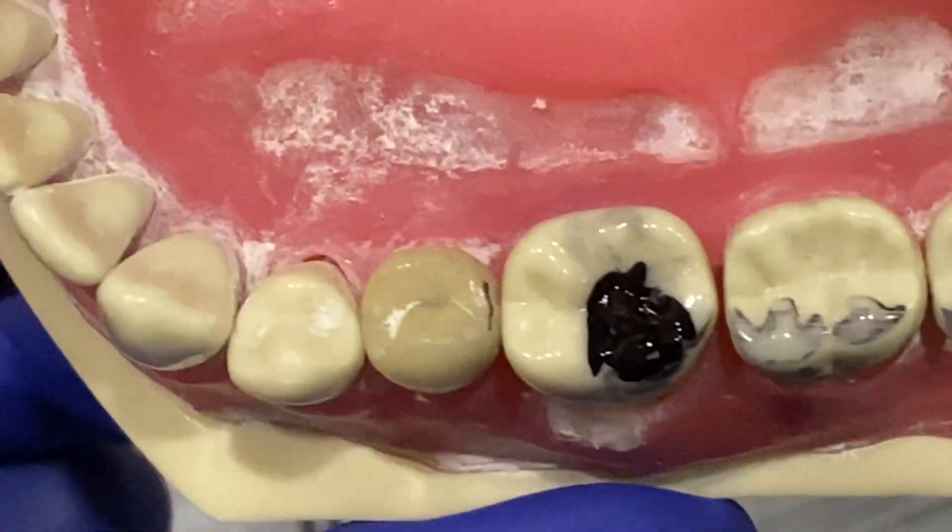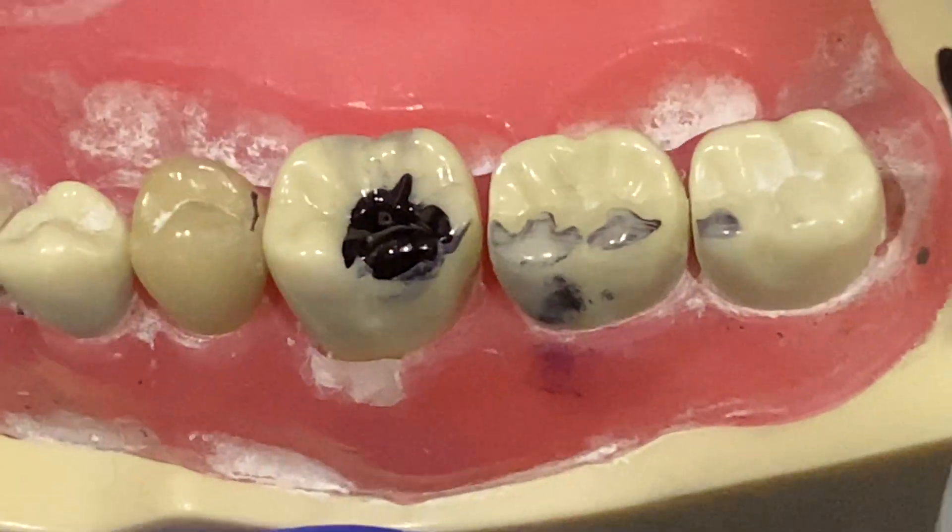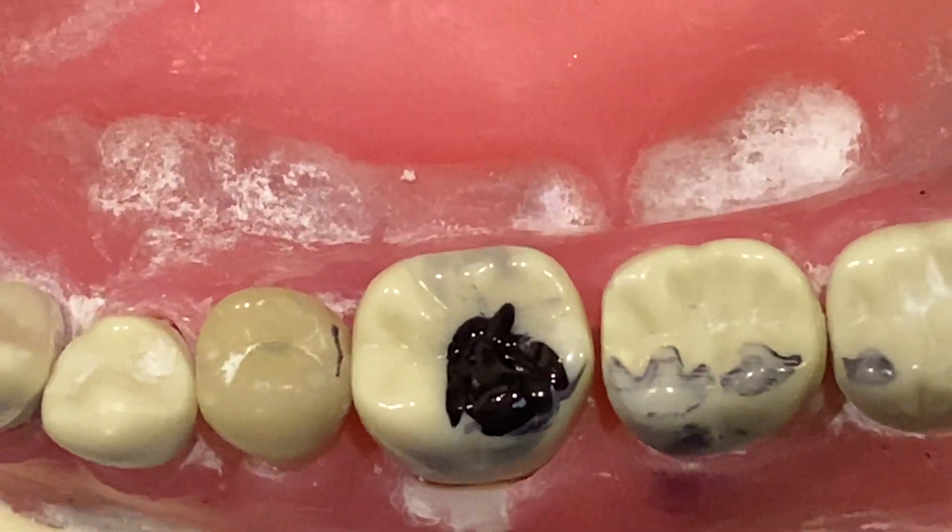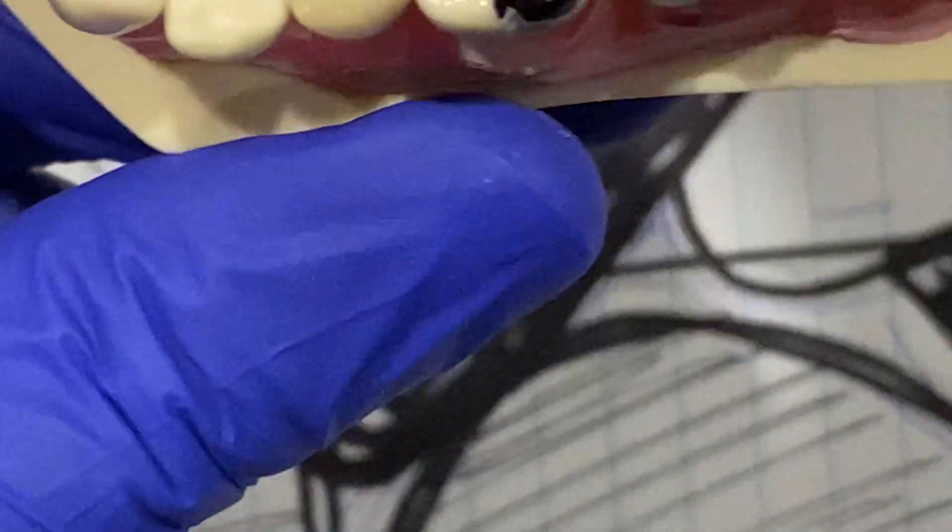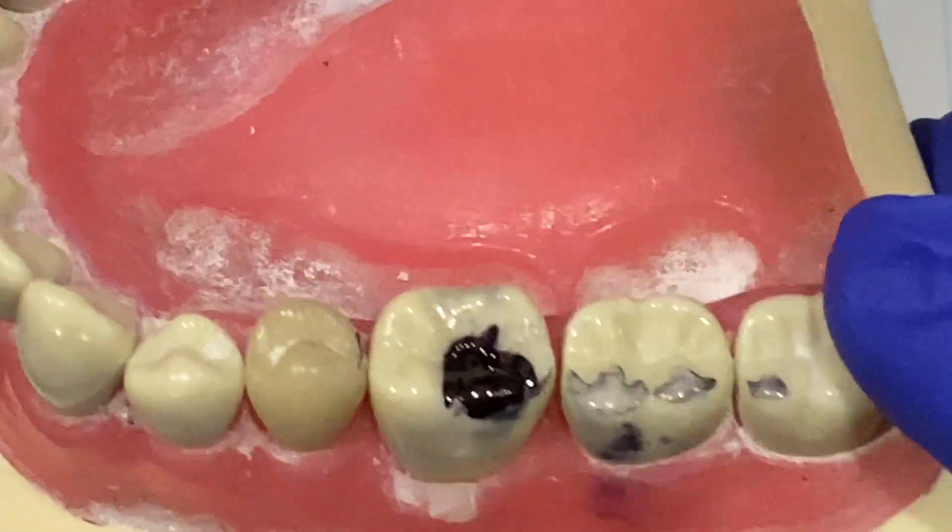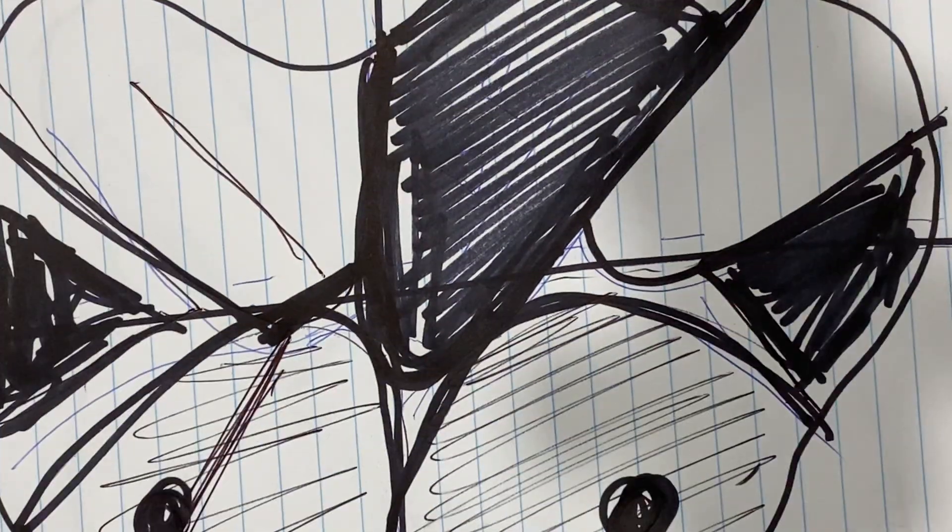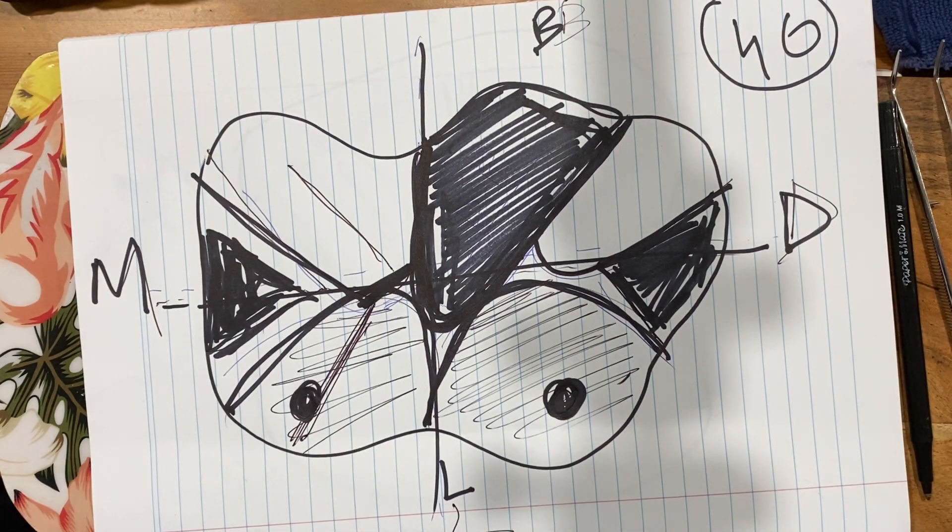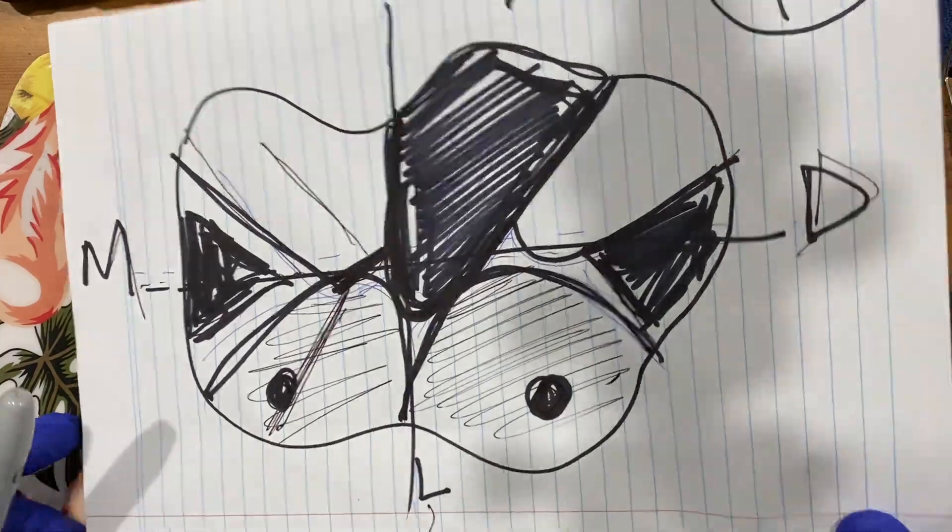And then what happens is the other two cusps start to divide, and that's very important. Look at your actual natural tooth and you will see if you get this A right, making sure it crosses the midline on both sides. If you get your A right, your whole anatomy gets better and everything starts to fall. If you don't get this A right, everything just starts to distort.